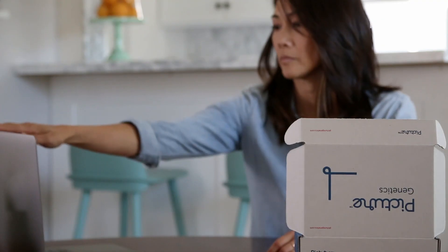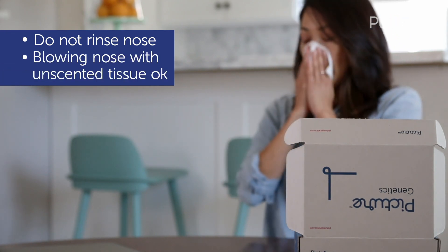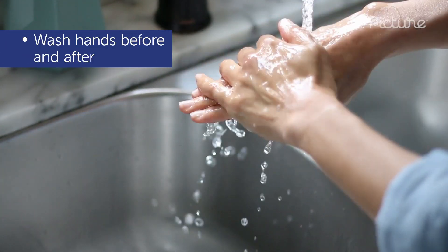Before taking the test, it is not recommended to rinse your nasal cavity, but blowing your nose with an unscented tissue to remove excess mucus is okay. Also, remember to wash your hands before and after taking the test.